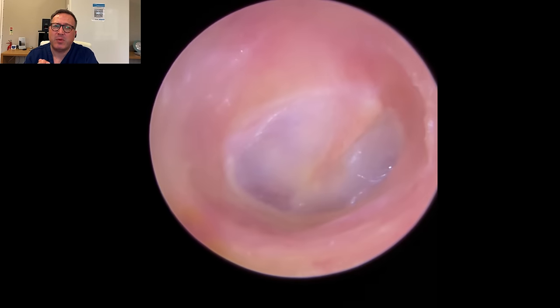The eardrum is a little bit dull, so not quite sitting in its normal position there. This is the patient's other ear. So what you can see here - same sort of issue - we're just going to use the standard Zolna tube here first of all.